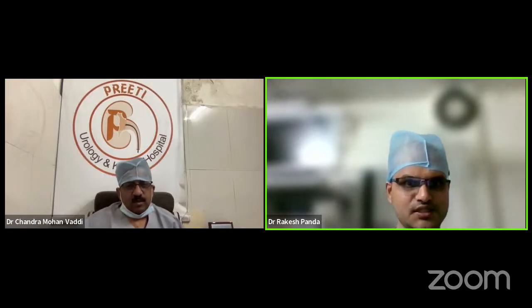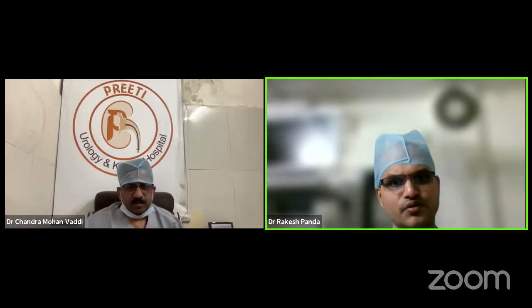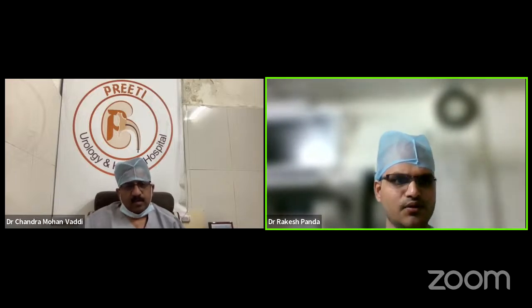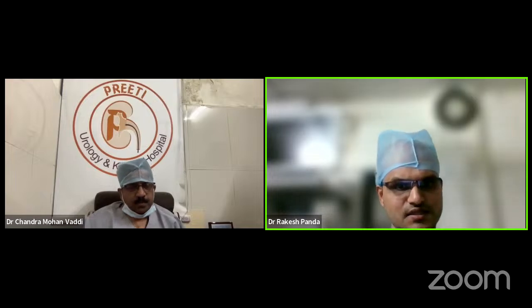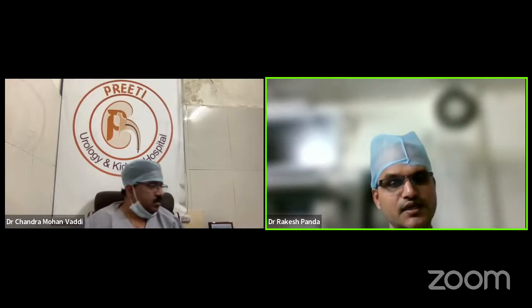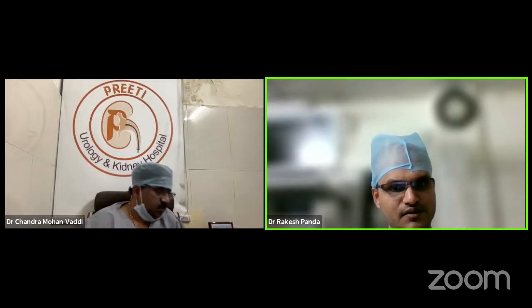What will you prefer for staghorn calculus? I'll show in a few RGPs, sir. Both supine and prone can be done, but I'll prefer prone, superior calyceal access. Because I look all the time down and I can clear the stones. From the superior calyx, it's easy to reach all the calyces. At one go we can clear, especially if the kidney has large, wide infundibula.